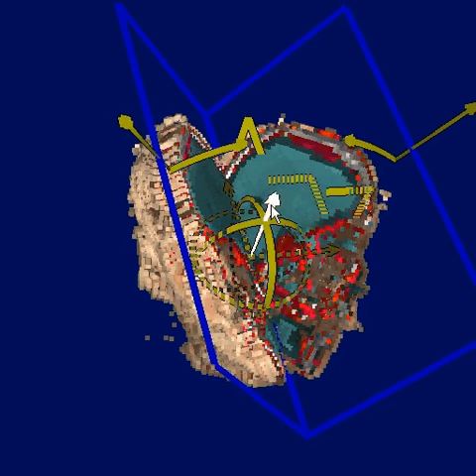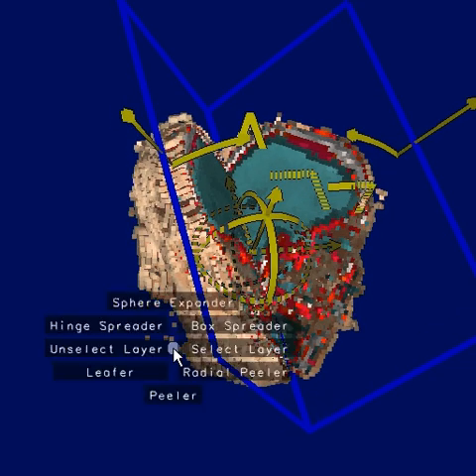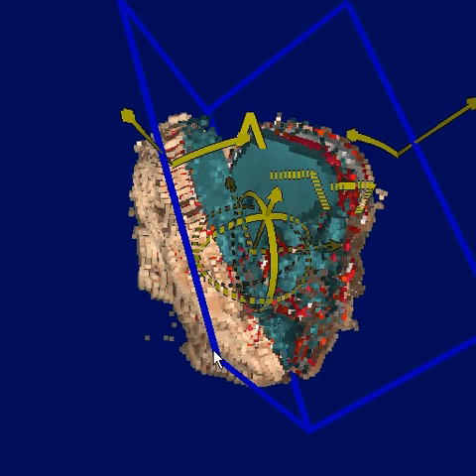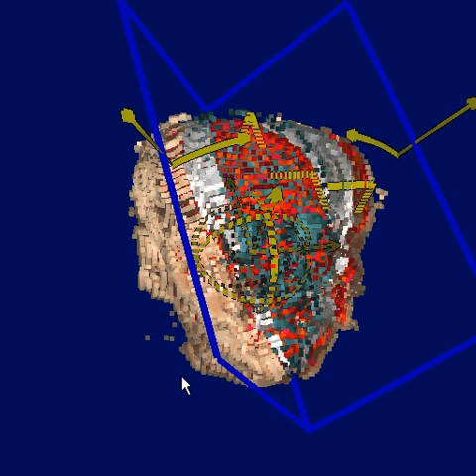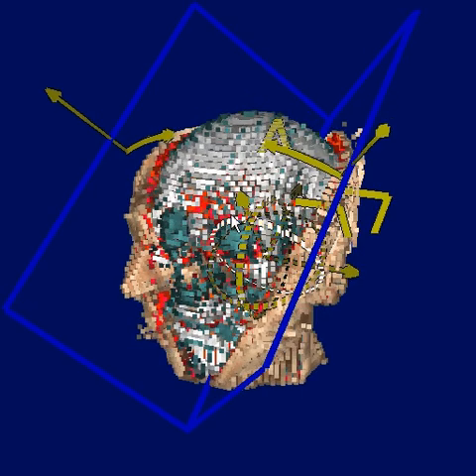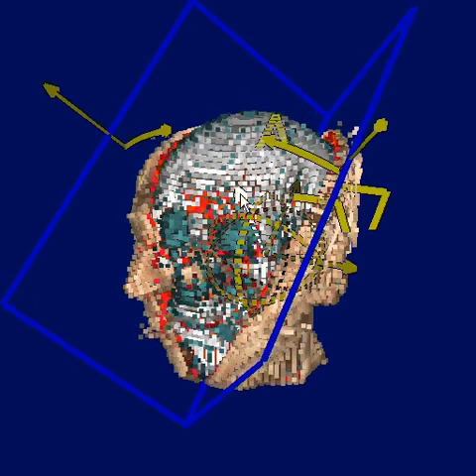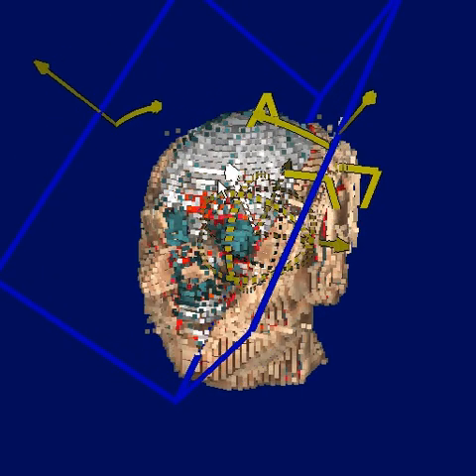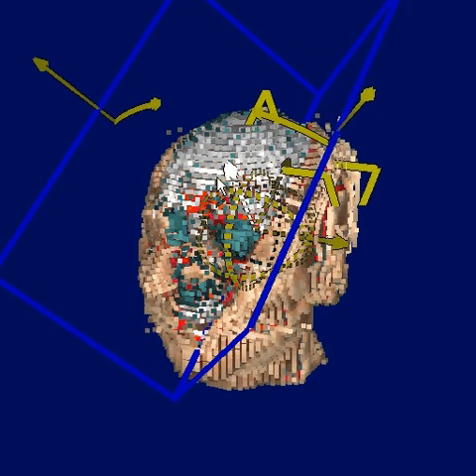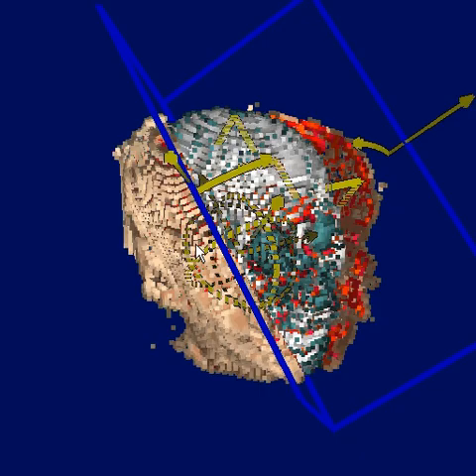However, if I make a flick gesture to the left, I unselect the innermost layer. And I can repeat this a couple of times to end up with a situation where the hinge is only cutting through the layers outside the skull. This is somewhat like an intelligent scalpel that knows to cut through skin, but to stop at bone.